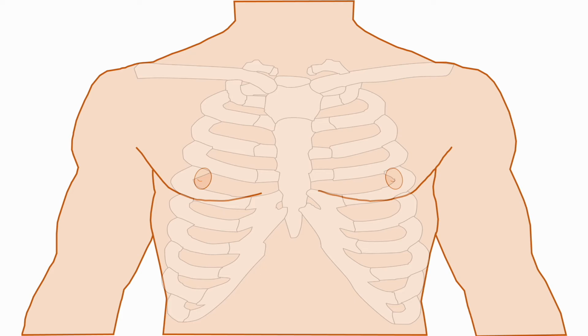The space below the first rib is the first intercostal space. You can palpate and count the spaces between the ribs until you reach the fourth, or if you start at the sternal notch at the top of the sternum and feel down, you'll feel a small step off, and this is called the sternal angle. This marks the second intercostal space. Move down 2 more and you will be at the fourth intercostal space.